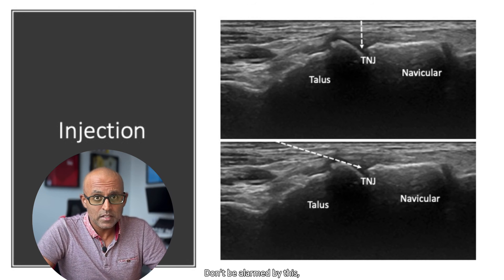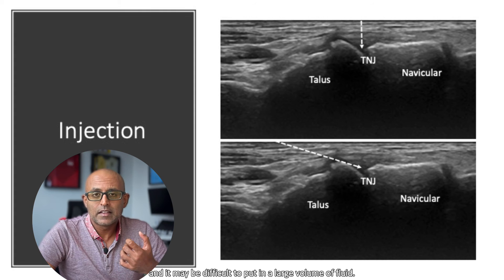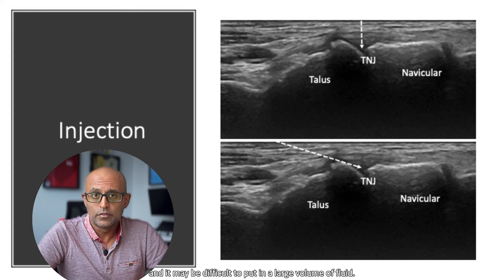Don't be alarmed by this, but sometimes you might need to do the injection in smaller aliquots, because the joint can be quite tight and it may be difficult to put in a large volume of fluid.